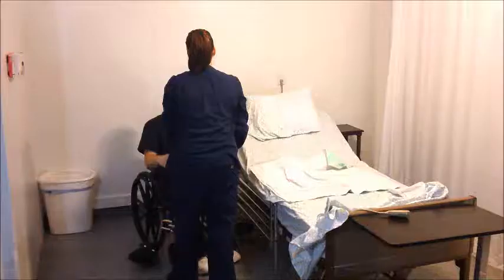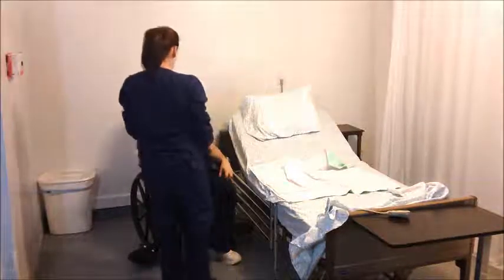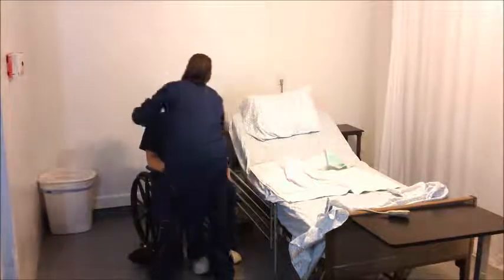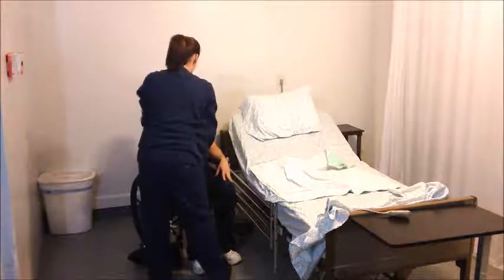Position the back of the client's legs against the seat of the wheelchair. Assist the client in a controlled, gentle lowering motion into the wheelchair with hips against the back of the seat. Position the client's feet on the wheelchair footrest and carefully remove the transfer gait belt from the waist.